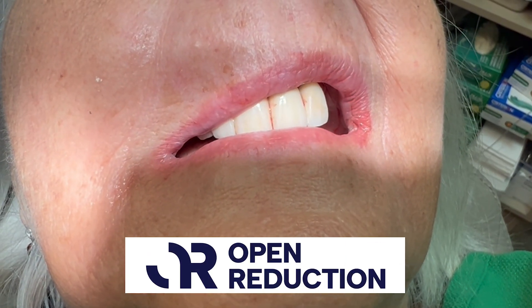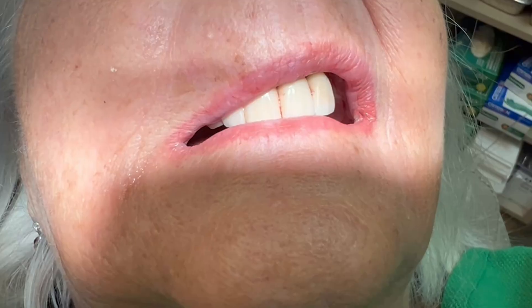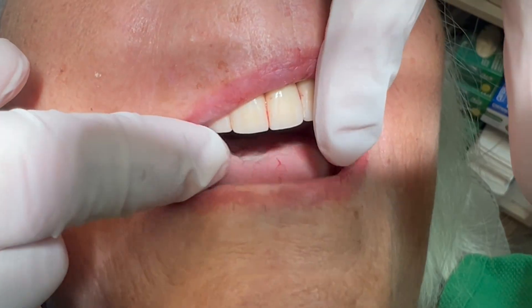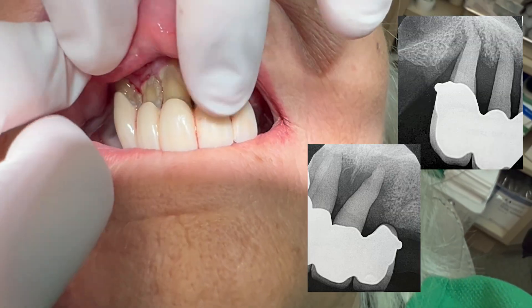This case isn't a teaching case — it's more of a warning about what can happen when oral health is neglected. These teeth don't look bad with the lip draped over them, but when I elevate the upper lip, you can see there is severe periodontal disease.